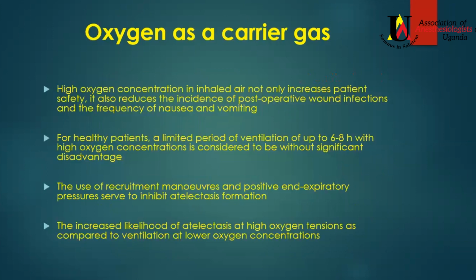Now, there are 3 options you have. You can use oxygen as a carrier gas. You can use oxygen and nitrous. You can use oxygen plus medical air. So we're going to look at each and see what the advantages and disadvantages are.